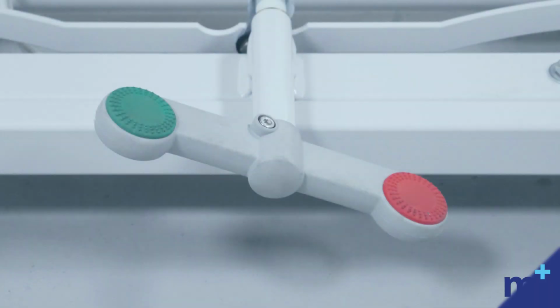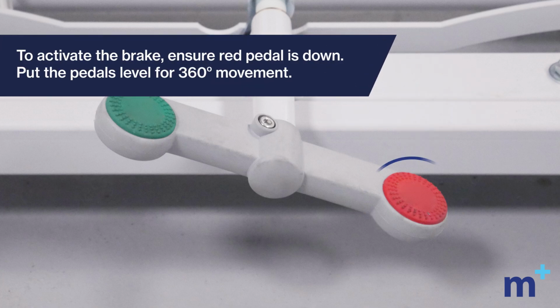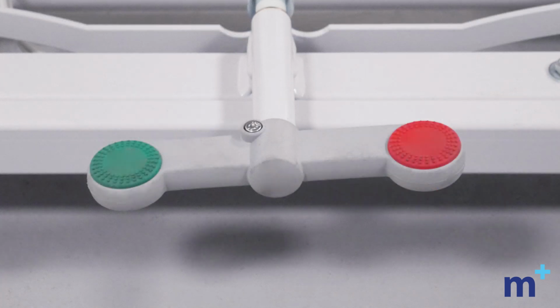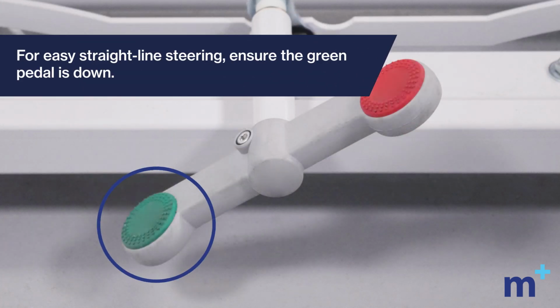The Versatech 700 has a central braking system which can be accessed via the foot end of the bed. To activate the brake, ensure the red side of the pedal is pushed down. For movement in any direction, put the pedal in the middle position. For easy straight line steering, activate the lateral mode by pressing the green side down.